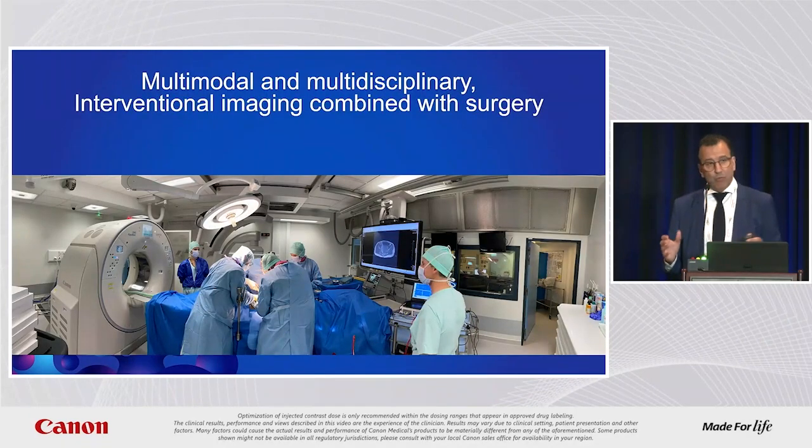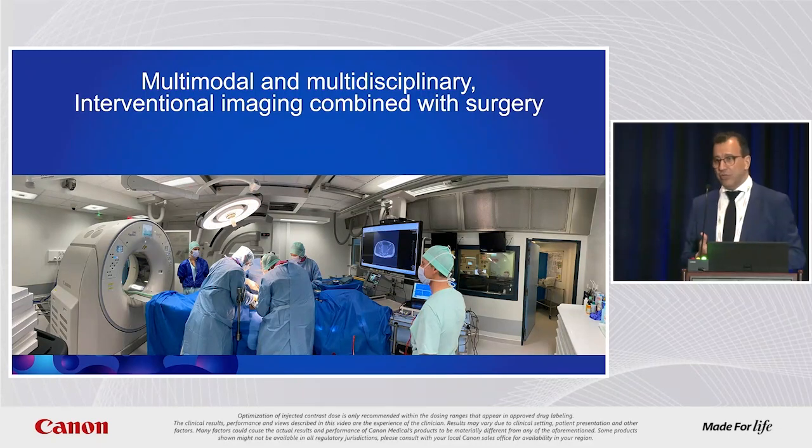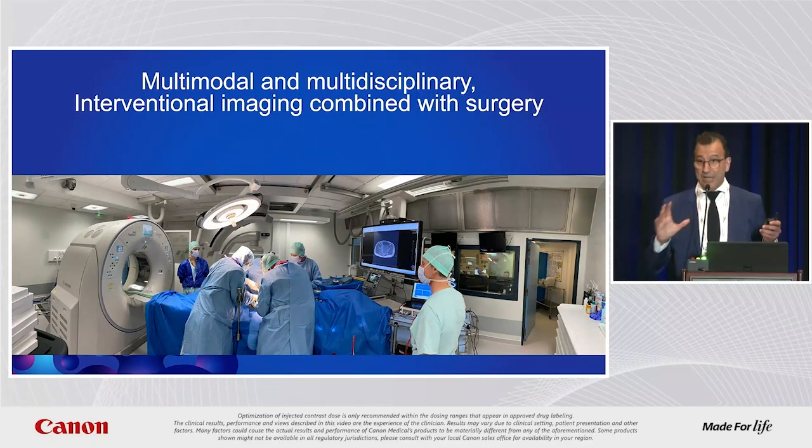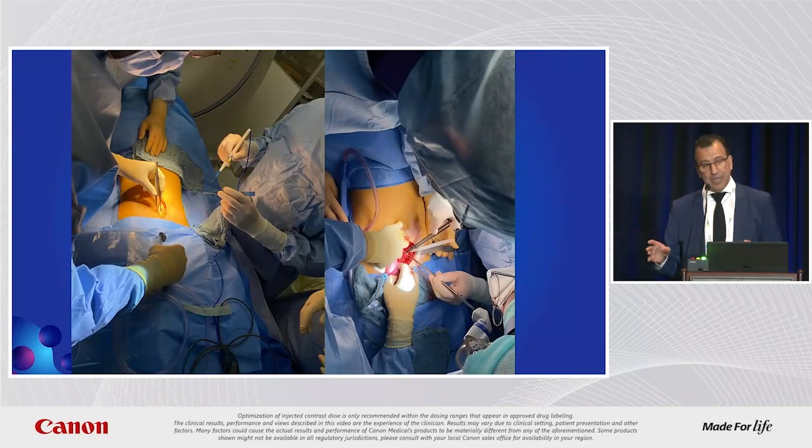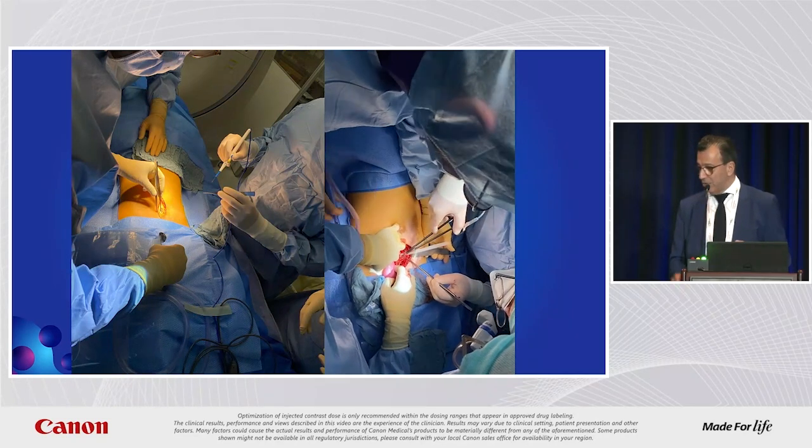So now what we do is we call our surgeons, because the room is installed as an ISO 5, meaning you can do surgery inside. Our colleagues and friends come to the room to make a mini lab for us. So we are very happy to work with them. And the lucky thing is the urologist is my best friend, so it's very helpful to have good friends in surgery. They come and begin to dissect.